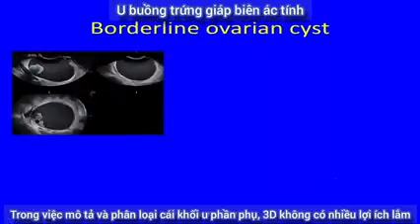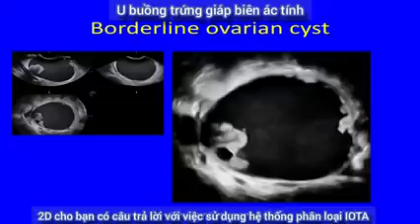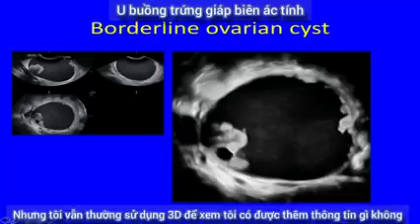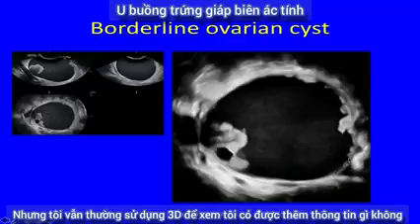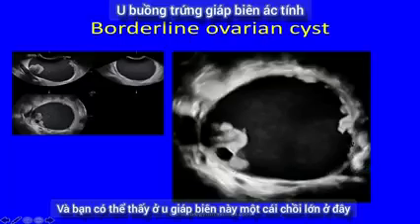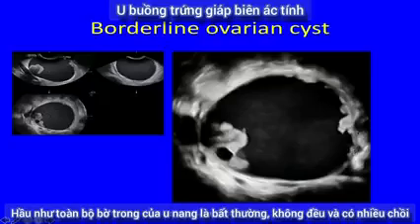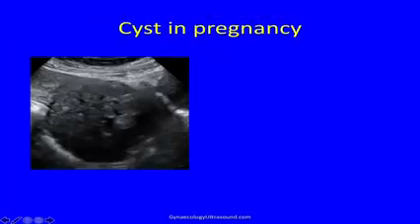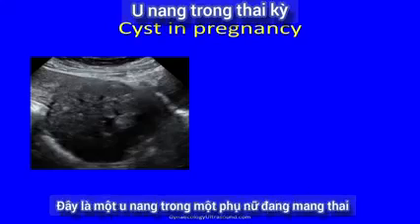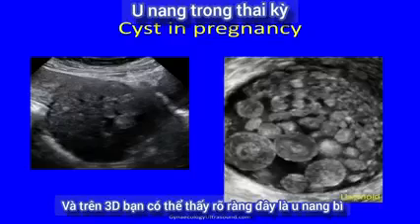In the characterization of adnexal masses, 3D is not so useful — 2D gives you the answer using the IOTA classification system. But I always put 3D on just to see what else I can see. In this borderline cyst you've got a large papillation, and almost all of the internal cyst wall is abnormal with irregularities and papillations. But in this case it was really useful to have 3D — this was a cyst in a woman in pregnancy, and on 3D you can clearly see that this is a dermoid.